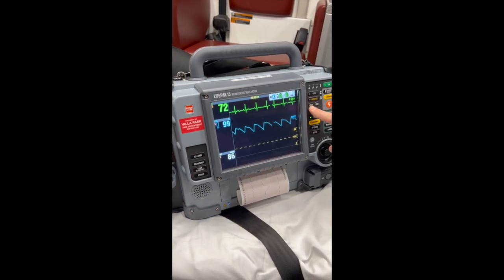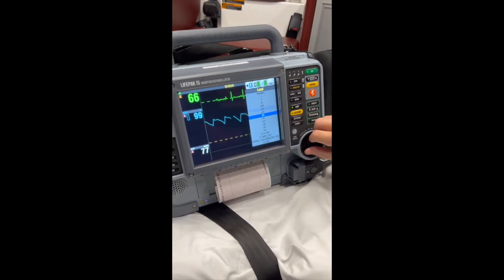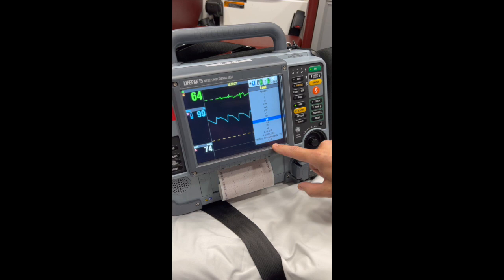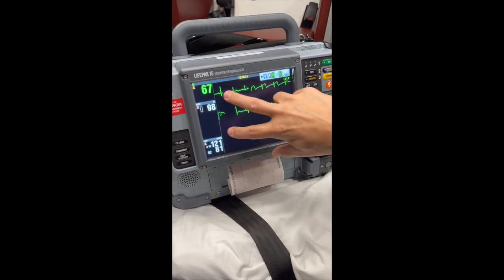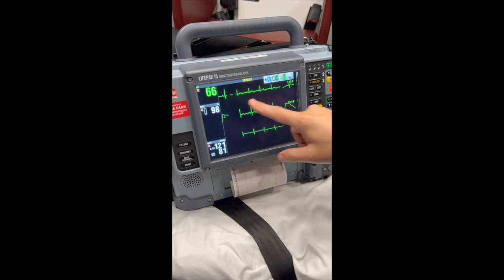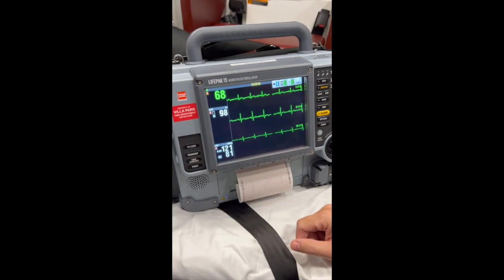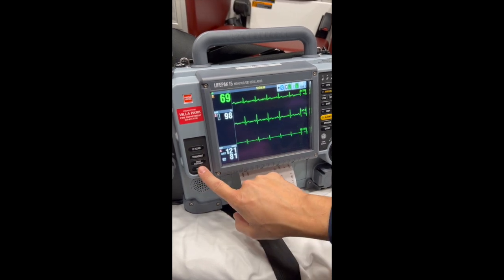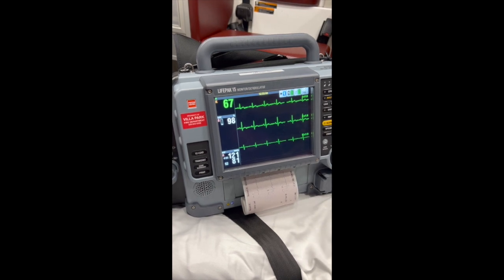Some of the other nice features on a LifePak: if you change your lead down to 2, 1, 2, and 3 leads, it will give you the cascading lead here. You need to verify asystole in all 3 leads. Hit the print button to capture it and be able to send a picture of that to ImageTrend.